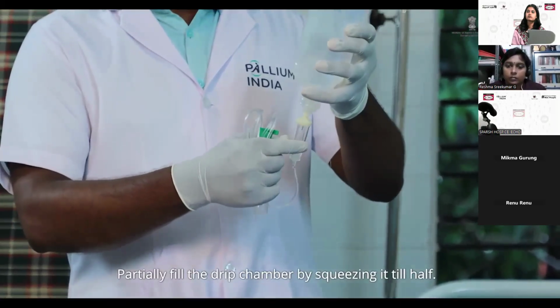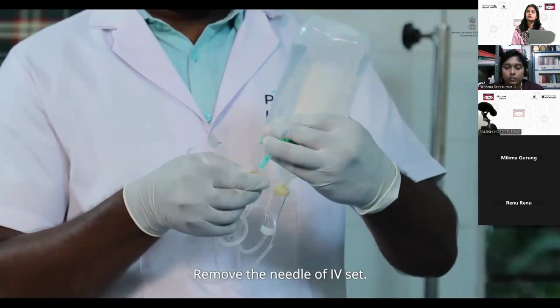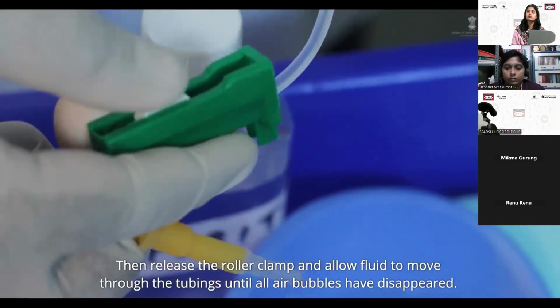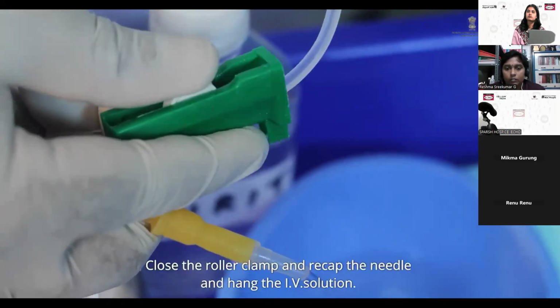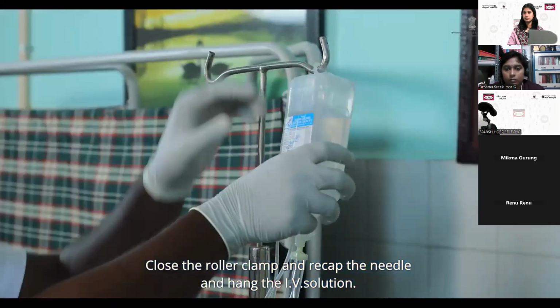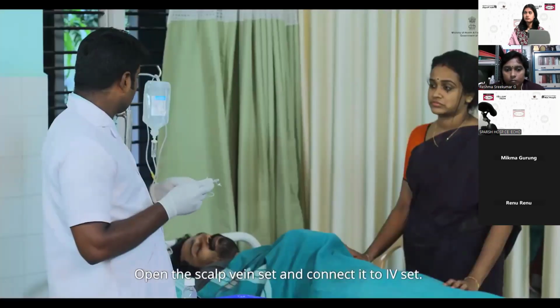Partially fill the drip chamber by squeezing it till half. Remove the needle of IV set. Then release the roller clamp and allow the fluid to move through the tubings until all air bubbles have disappeared. Close the roller clamp and recap the needle and hang the IV solution. Open the scalp vein set and connect it to IV set.